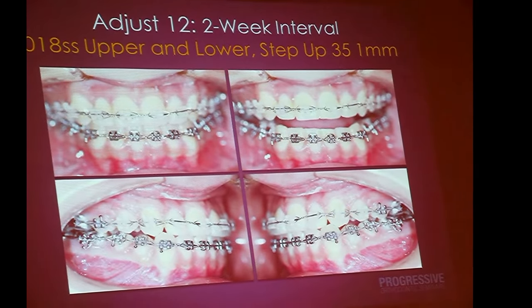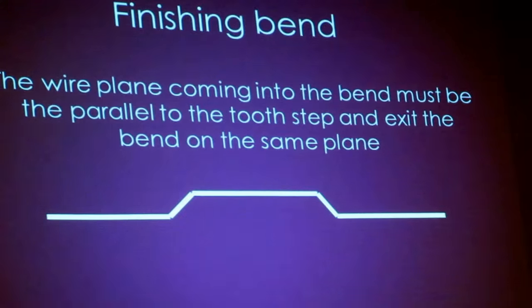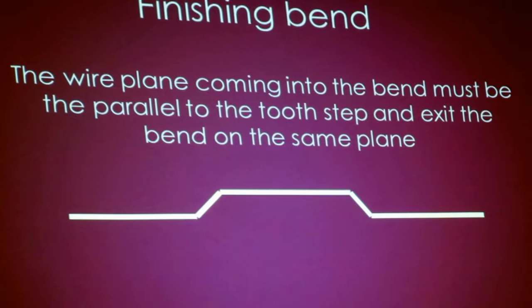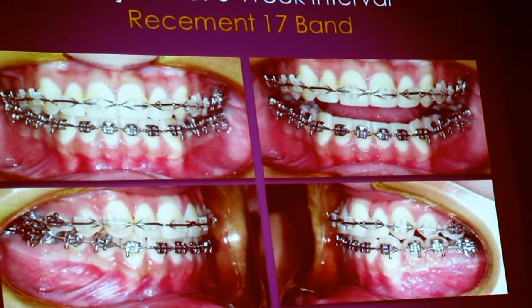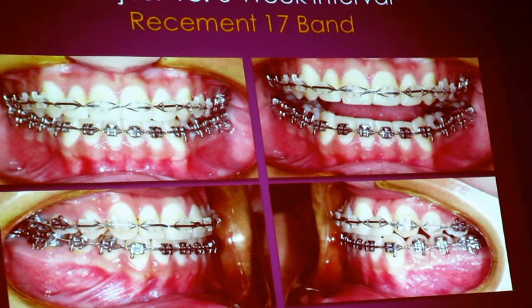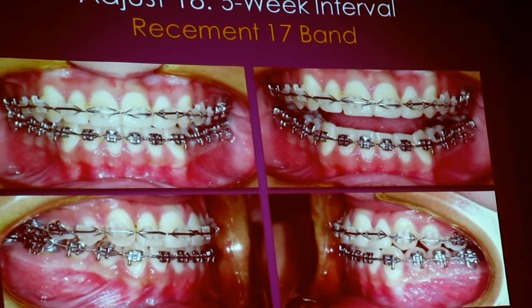You still have to know which pliers you use to do a first order bend. Okay, so we see that is a more complex finishing bend.